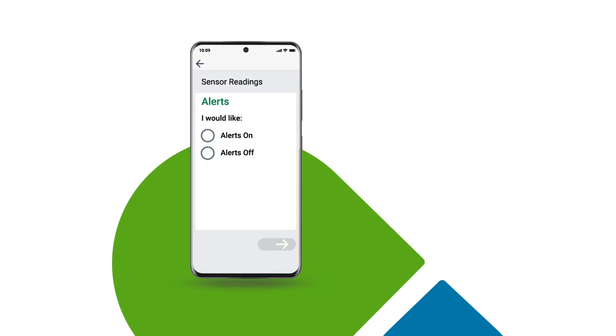Dexcom One offers alerts that let you know when your glucose has gone too high or low. You will come to a screen where you can turn these alerts on or off. Let's turn the alerts on — you always have the option to turn them off later.